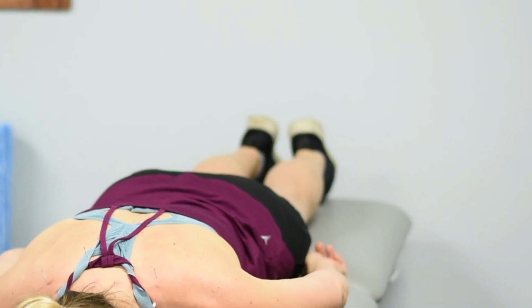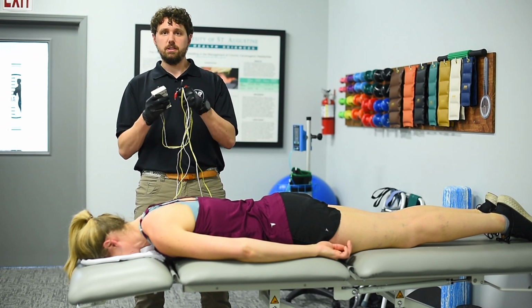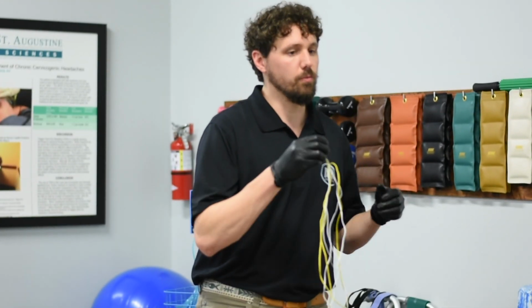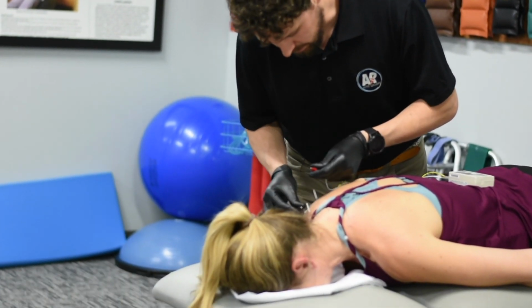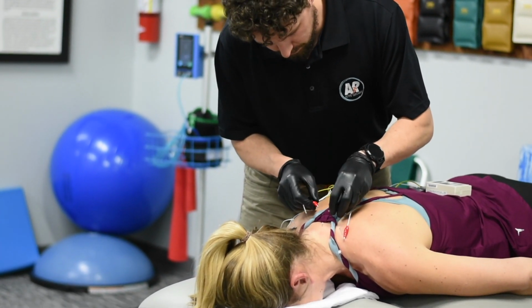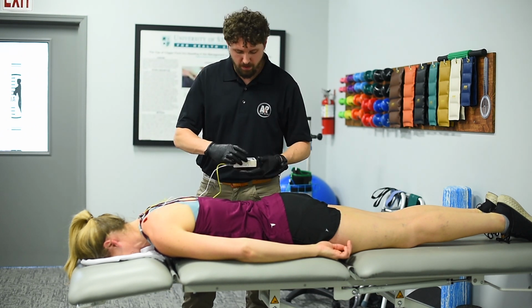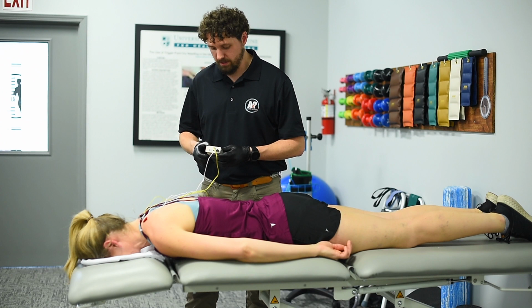I also have another unit. This unit's a little bit different. It has what are called gator clips, which actually clip onto the needle. I do this in times where I want to leave this on a little bit longer. So I clip onto the needles here. And then from here, it's similar. I slowly turn up until she can feel it.